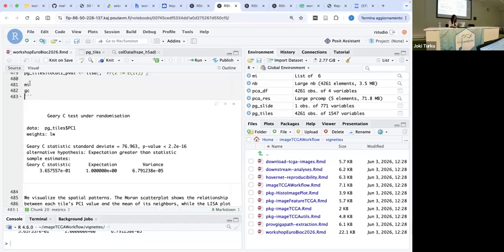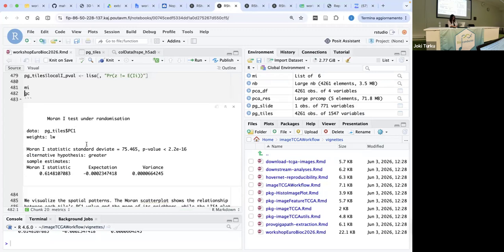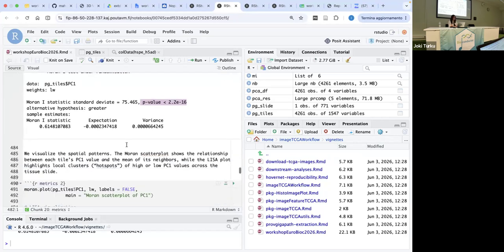Yeah, so here we have just the Moran test, in which you can see that one of the important things is just to check the p-value. And in this case, it's lower than 0.05. So it says that our cells tend to cluster all together, but that's more like a global metric. But you can also have this information for each nuclei cell in your data.